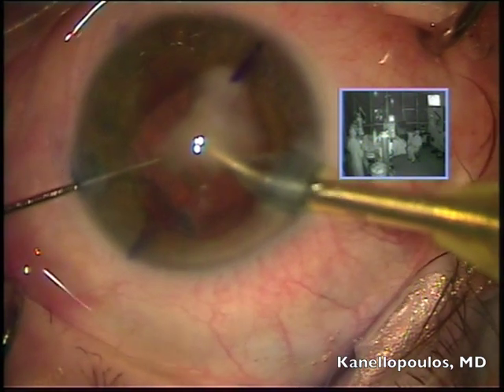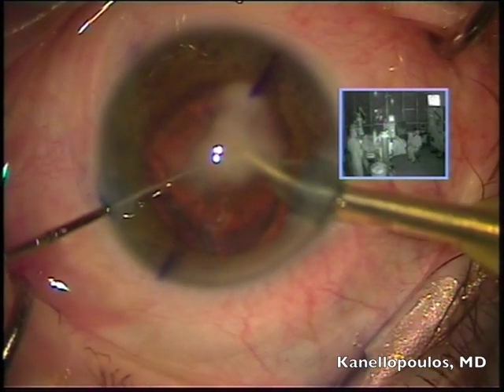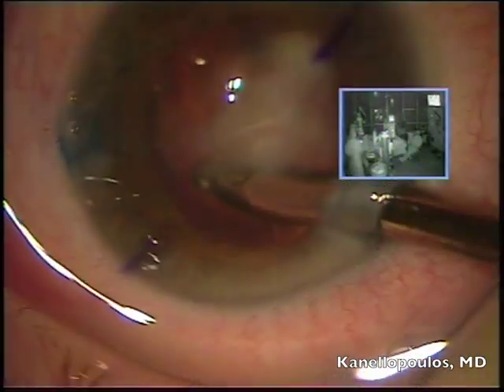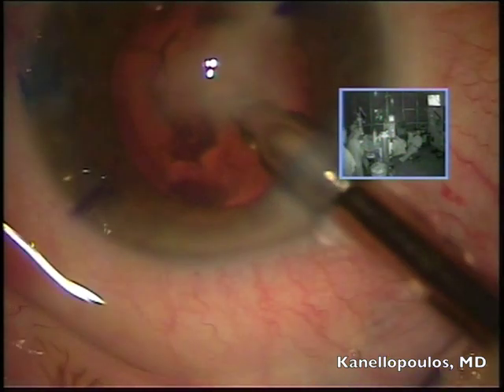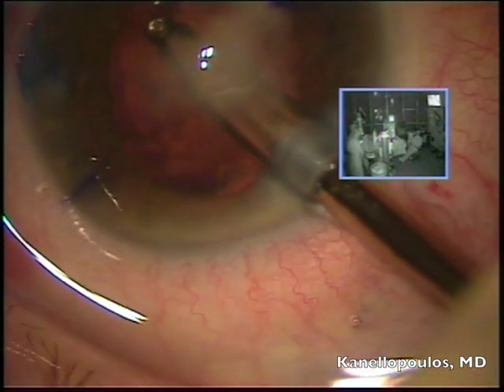We went backwards because of the patient's final request. The patient and her daughter, family is very significant in Greece, decided to do the cataract first, see how the vision improved from there. Remember, this eye was hand movement prior to our cataract procedure. The other eye is 20/20 and pseudophakic.